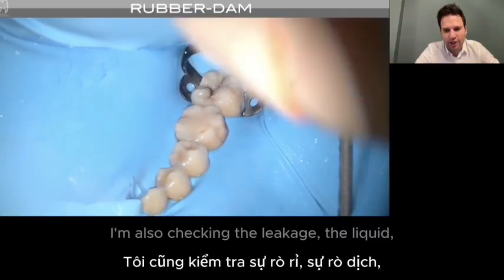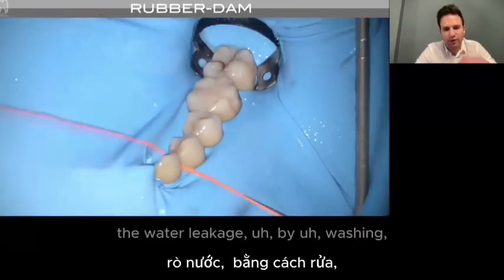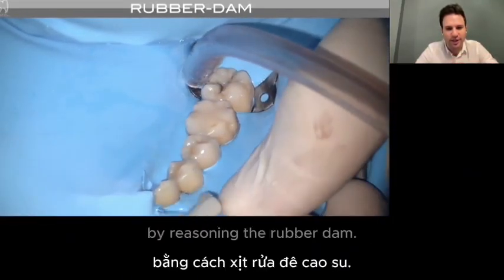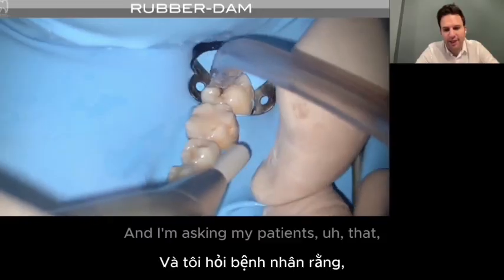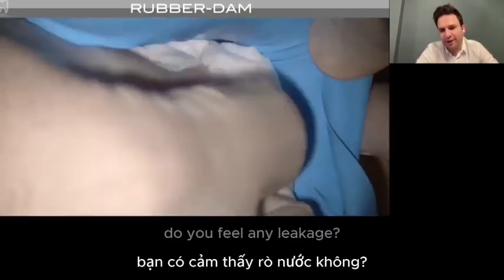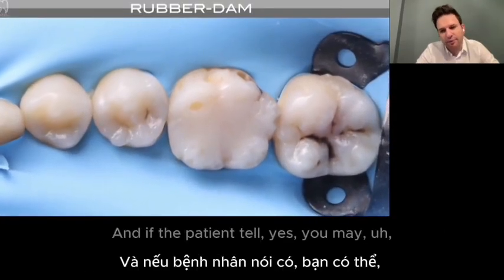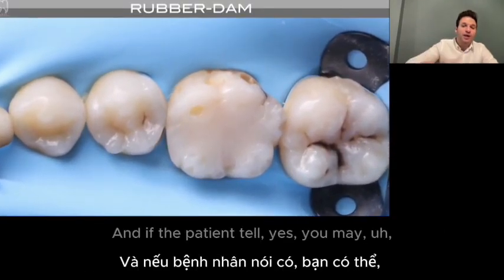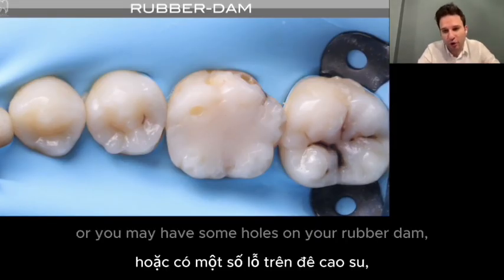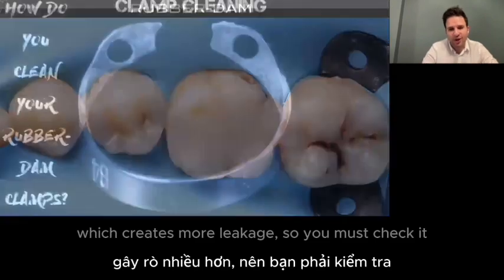I'm also checking the water leakage by rinsing the rubber dam. And I'm asking my patients, do you feel any leakage? Do you feel any water inside your tooth? And if the patient says yes, you may have some torn area, or you may have some holes on your rubber dam, which creates more leakage. So you must check it.